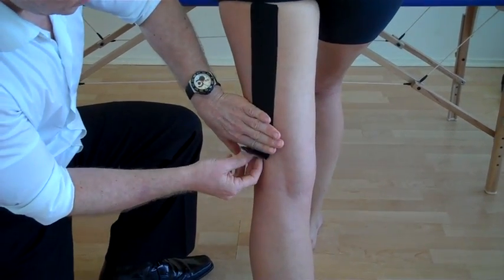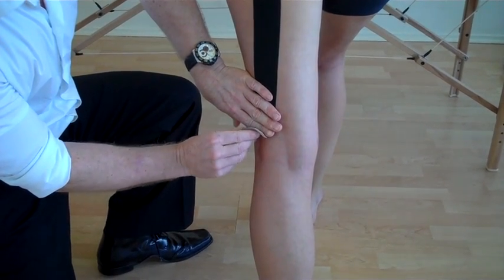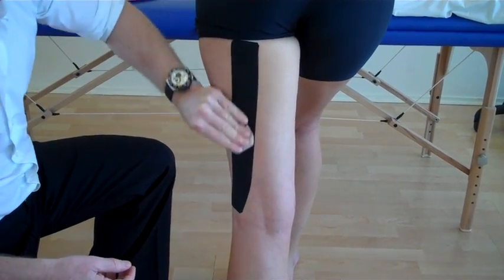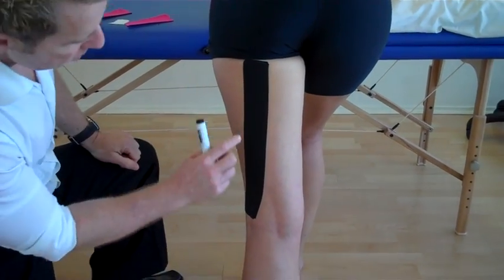So come down. The last bit as it goes towards the head of the fibula, try not for it to go too much behind the knee — you can just feed out. And just warm up with your hand while using the back of the tape, just to warm it up.